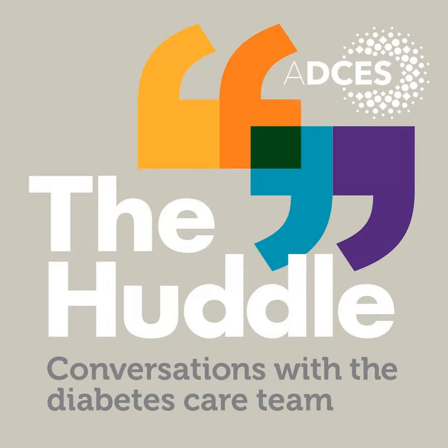So there's actually 4 different personal CGM devices, and there is one that's implantable, that is Eversense. There are 2 that are kind of real-time, constantly updating, and that's Dexcom and Medtronic. And then the Libre Flash, that actually is the one where you have to scan it to see the reading. So it wouldn't give you alerts about high and low glucose readings, but you scan it and then get to see that information.